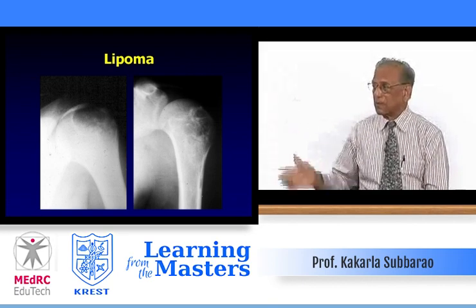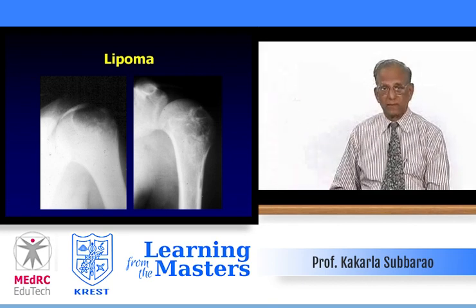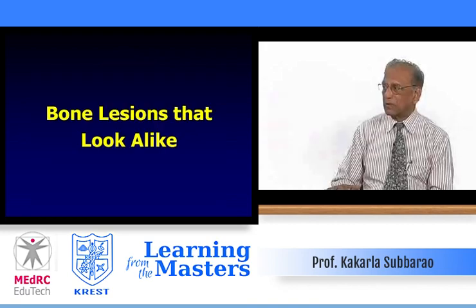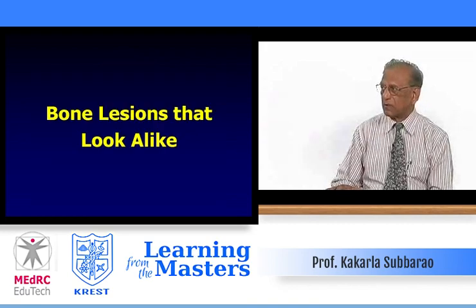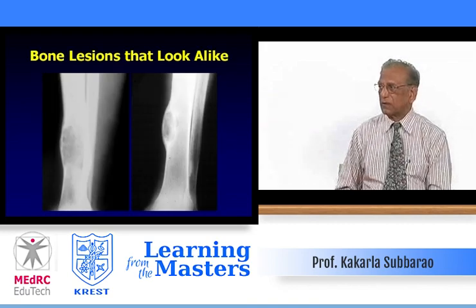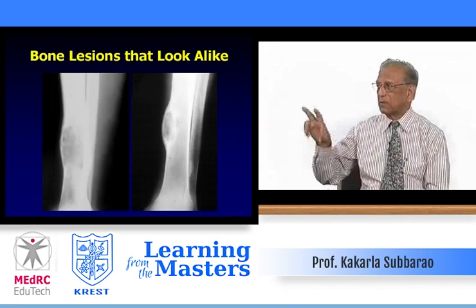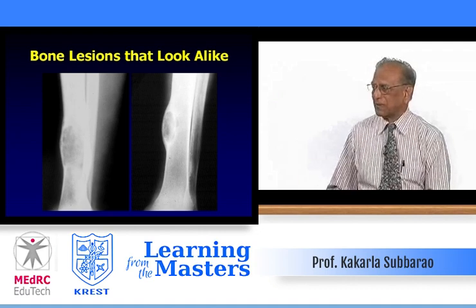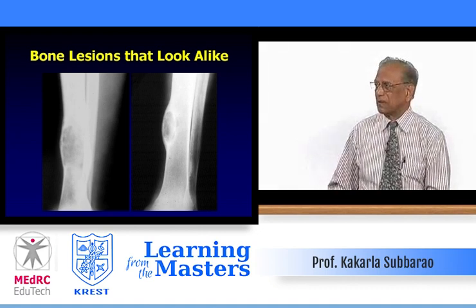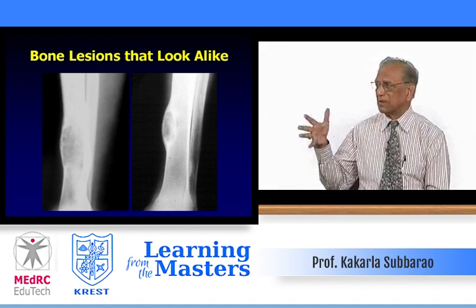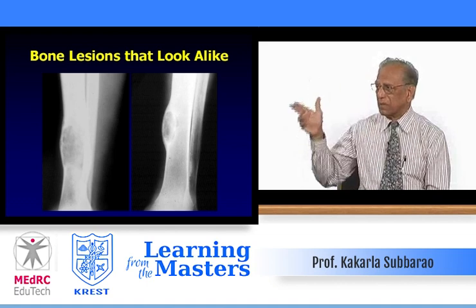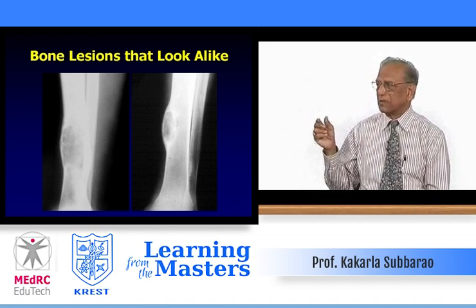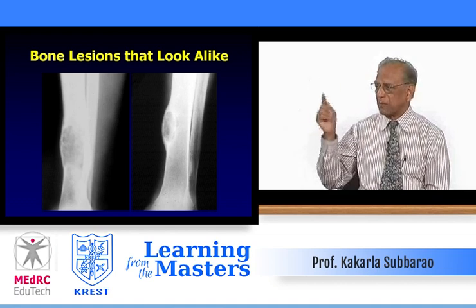Calcification cases — on the left side, calcification below the neck of the femur; on the right side, a little more lateral. On the left side there is an osteochondroma — exostosis. Look at the cap: it is lobulated and irregular, arising from the skeletal cortex. On the right side, it also looks like exostosis, but this is post-traumatic — a calcified hematoma. Occasionally if the patient had repeated femoral punctures for catheterization, you may get a calcified femoral artery aneurysm.